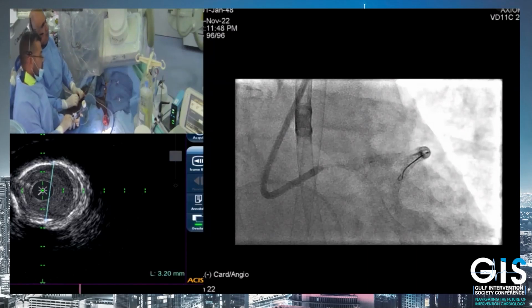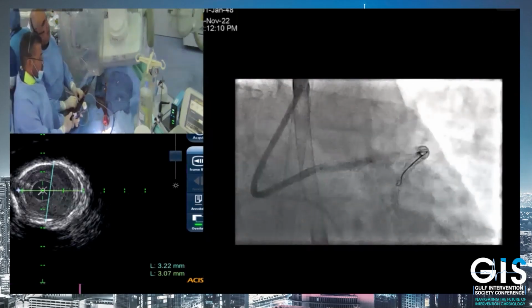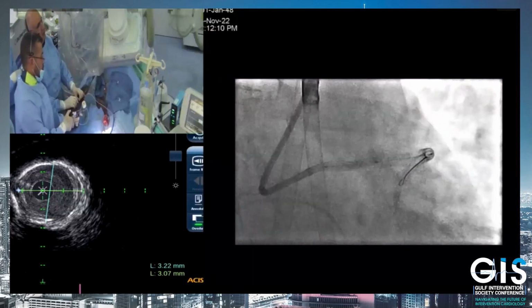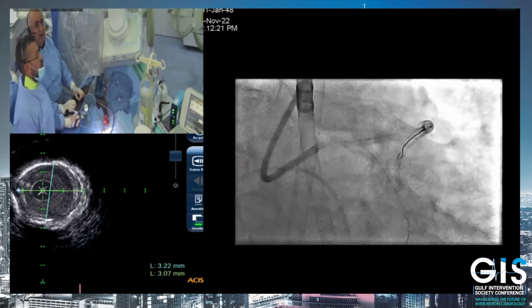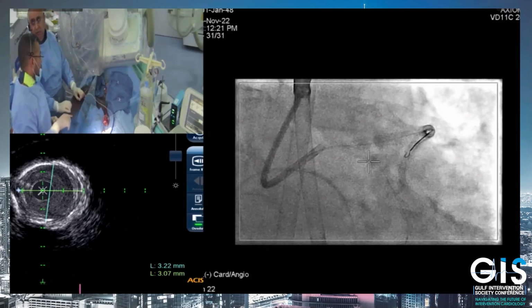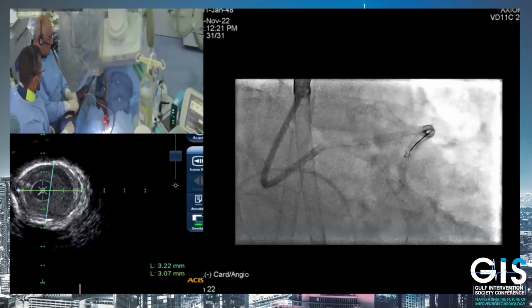Okay, let's go for 6, 10, 14, 16, 18, 20. All right. The proximal end of the stent by IVUS is 3.25 by 3.1. I think we can take 3.5, 3.5 should be fine for the distal part. And then Gabriel, maybe a 4 for the proximal. What would you do strategy? The left main is provisional at this point, 4.7 by 4.8, so I nearly mean 5. Giving the information, we'll take a 4 stent.